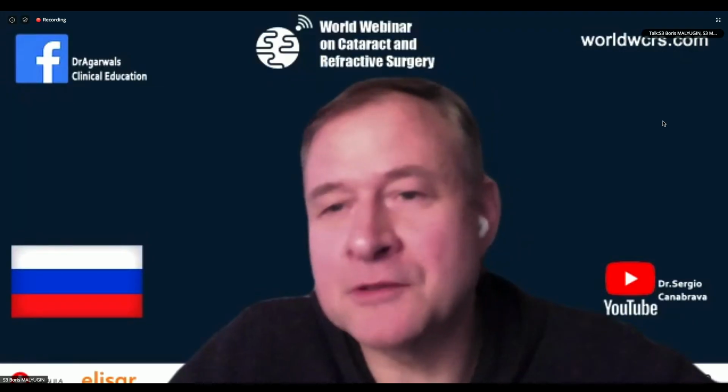Yeah. With the femto, I forgot to tell you, but I don't have any experience using the ring with femto. So I use it in normal cases, not with femto yet. But I talked to Sergio and Dr. Bach, and they try to take all the viscoelastic off the eye and put some BSS and then do the femto.